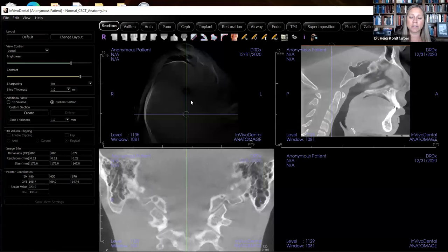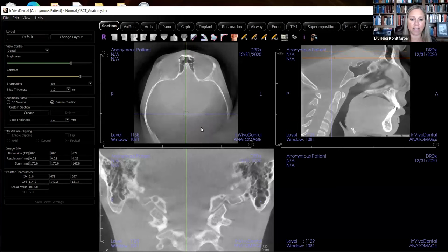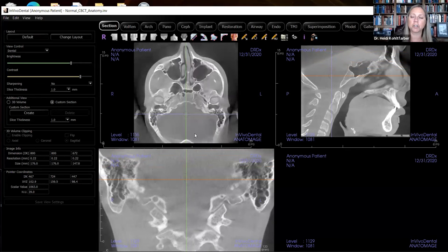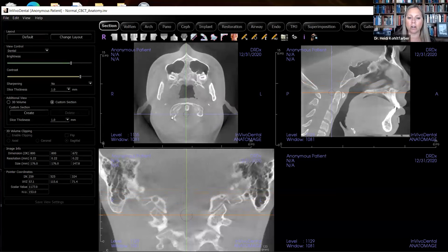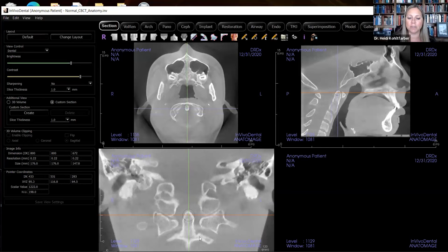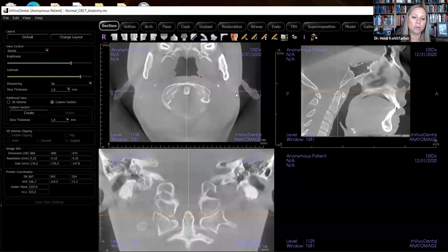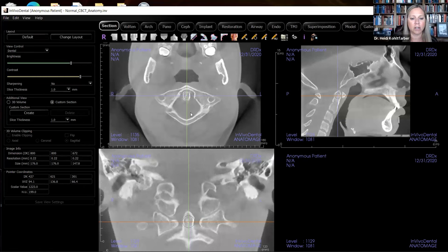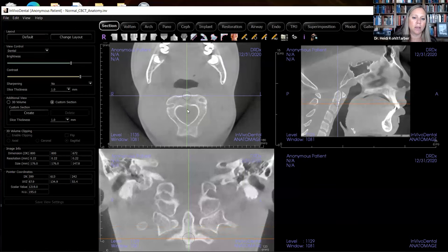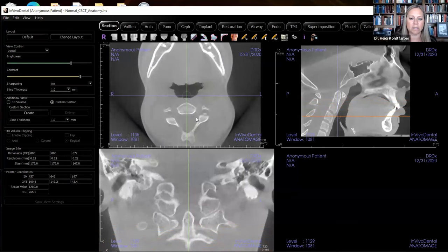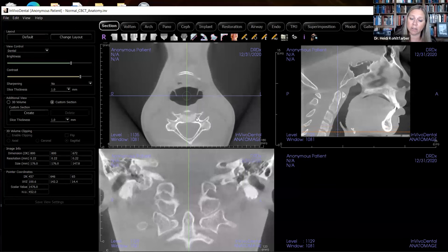Now we're up at the top again. We're going to come back down looking at the posterior aspect of the scan, making sure our cortical borders are nice, smooth, and intact. We head down through the foramen magnum, look at our cervical spine, and see the odontoid process of C2 — called 'odont' because it looks like a tooth. Everything does go back to dentistry. Going down through the cervical spine, we've got a transverse foramen, the spinal cord within our vertebral foramen, making sure everything looks fairly symmetrical, noting that some variation between sides is normal.